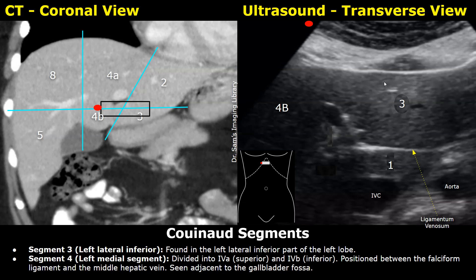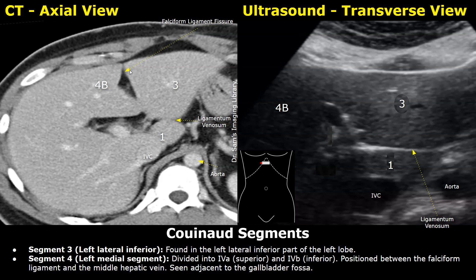This upper part of the liver is segment 3. The probe is placed so we can see segment 3 anteriorly and segment 4. Laterally it is segment 4b. You can also see the portal vein here. In this axial or transverse image you can also see the falciform ligament fissure. This image shows the lower aspect of the left lobe, which is segment 3. Adjacent to segment 3 will be segment 4b on the other side of the falciform ligament — so segment 4b and 3 are next to each other. Posteriorly, you will see the ligamentum venosum fissure in the CT image.